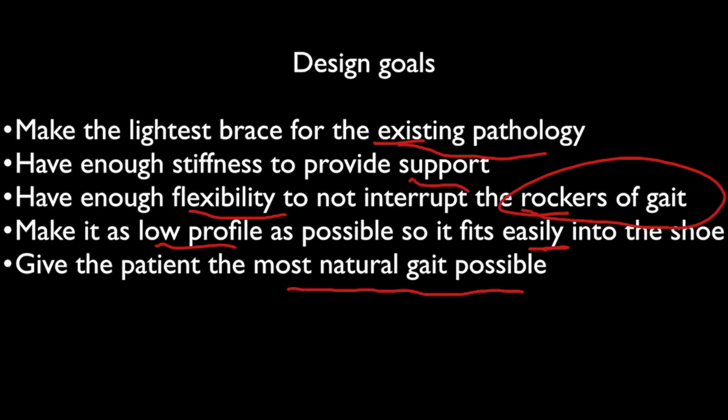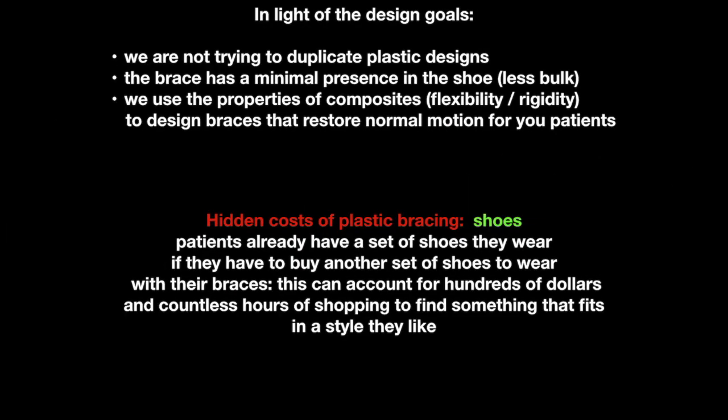So these are our design goals when it comes to making a carbon fiber AFO. And they're important for us to keep in mind, because this is the guiding principles by which we can make a really lightweight brace that is very functional for your patient. So we're not interested in duplicating plastic designs, although we can. We just don't think it's necessary, and the brace needs to have a minimal presence in the shoe, and yet it has to be a combination of flexibility and rigidity that helps restore gait.